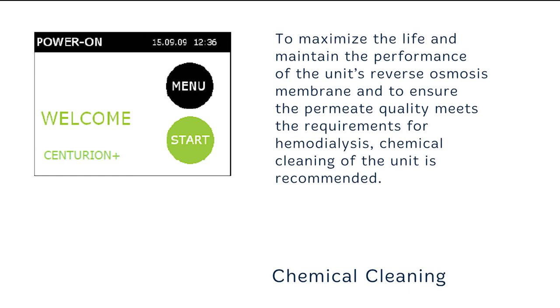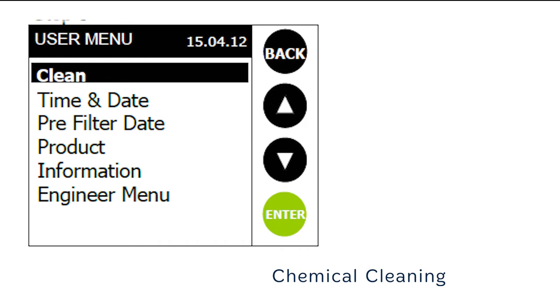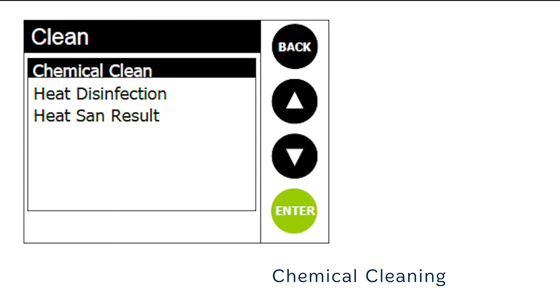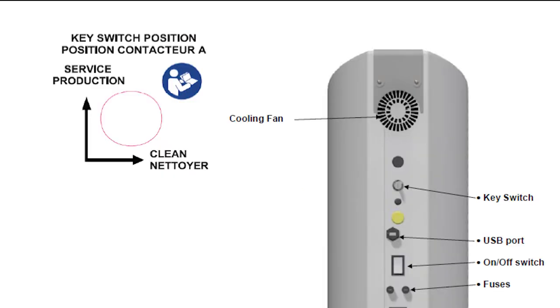From the power on screen, select menu. The user menu will be displayed. Turn the key switch in the rear of the unit to the clean position. If this is not selected, the unit will revert back to the power on screen if a chemical clean is attempted. From the drop down user menu, select clean and press enter to proceed to the next step. Select chemical clean from the menu listing, then press the enter button. When the message 'are you sure' is displayed, press yes. You will then be prompted to turn the key at the rear of the unit to the clean position, and the chemical clean routine will then start.